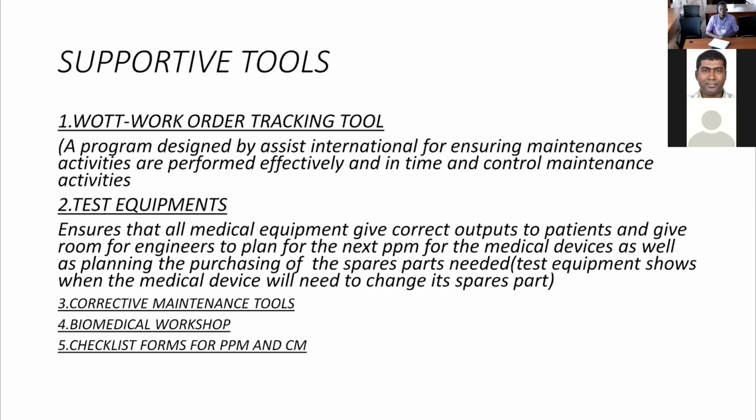The second one, we are having the test equipment provided by Assist International. This test equipment ensures that all medical equipment give correct outputs to patients and gives room for engineers to plan for the next PPMs for the medical devices, as well as planning on purchasing of spare parts needed.